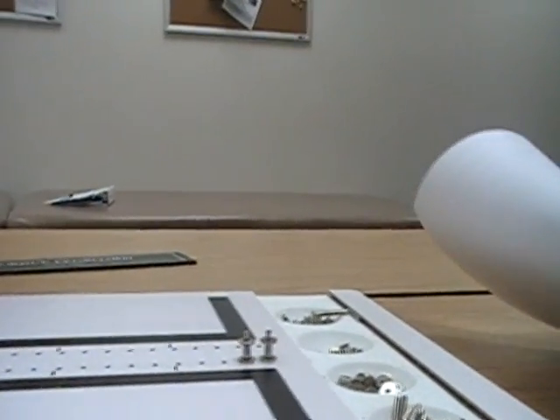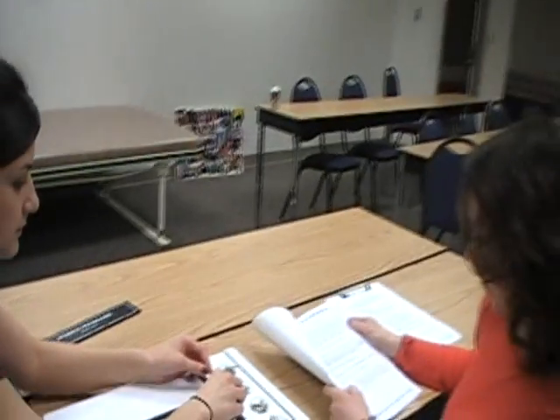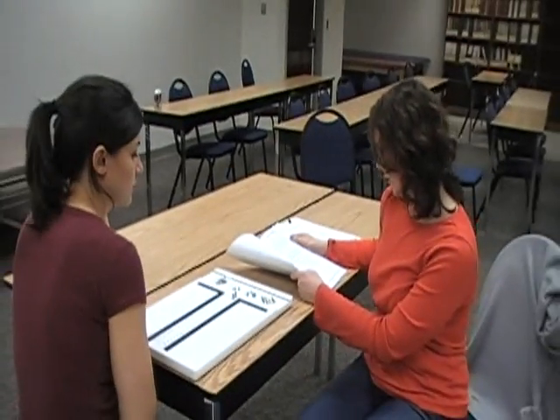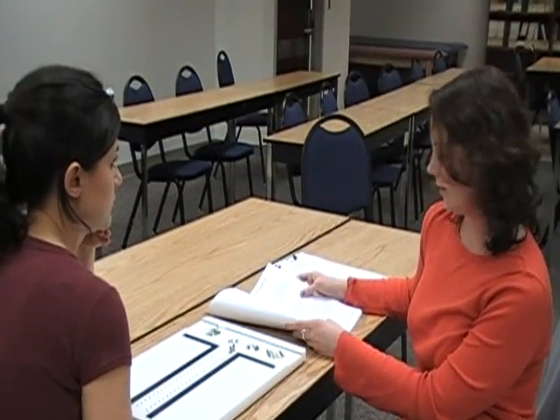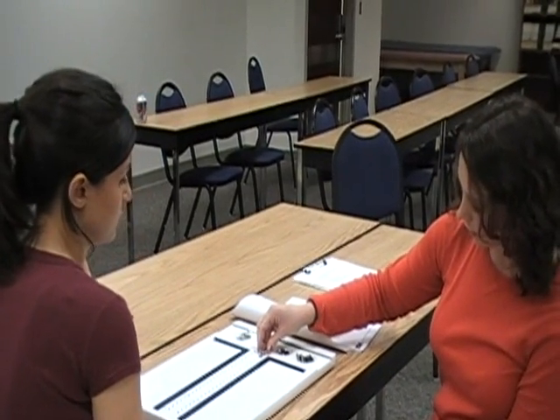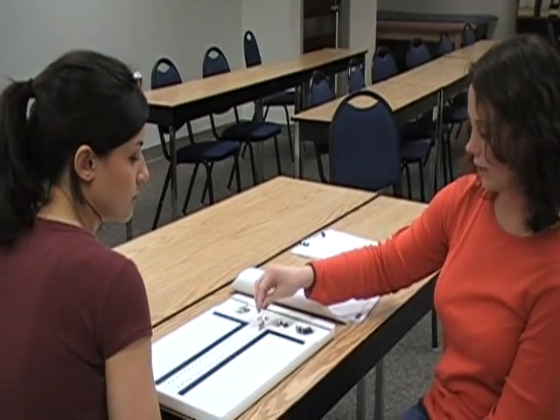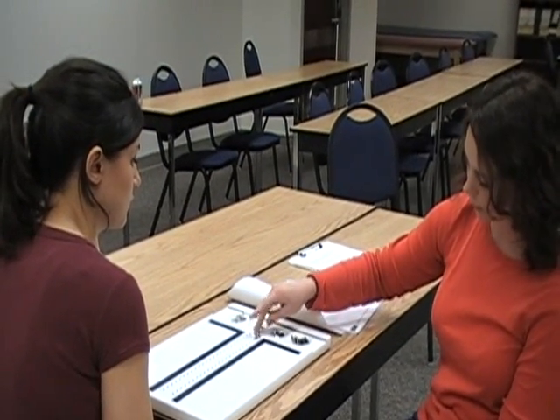After practice, ask them to stop and return the pins. Then say: 'When I say begin, make as many assemblies as possible, beginning with the top hole. Work quickly until I say stop.' Give them one minute, then say stop. Since each assembly has four parts, each is worth four points — count the total number of assemblies and multiply by four. For example, if the subject completed two assemblies, the total score would be eight. That concludes the Purdue Pegboard Test.